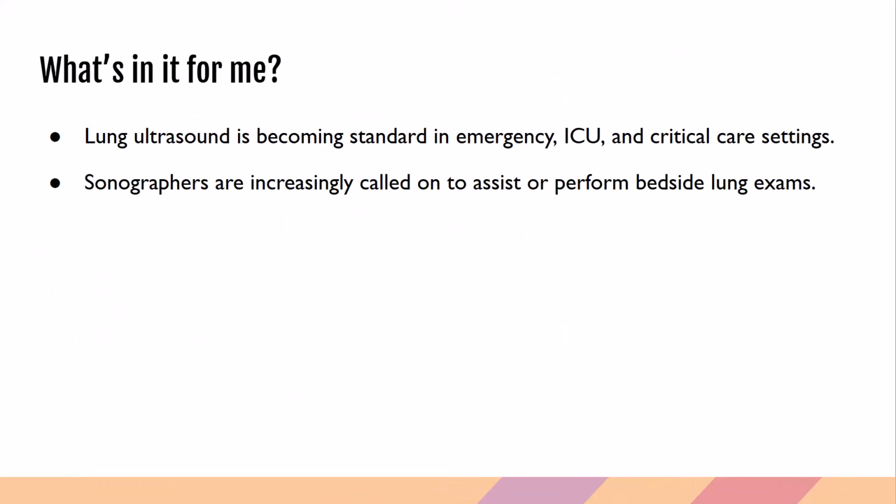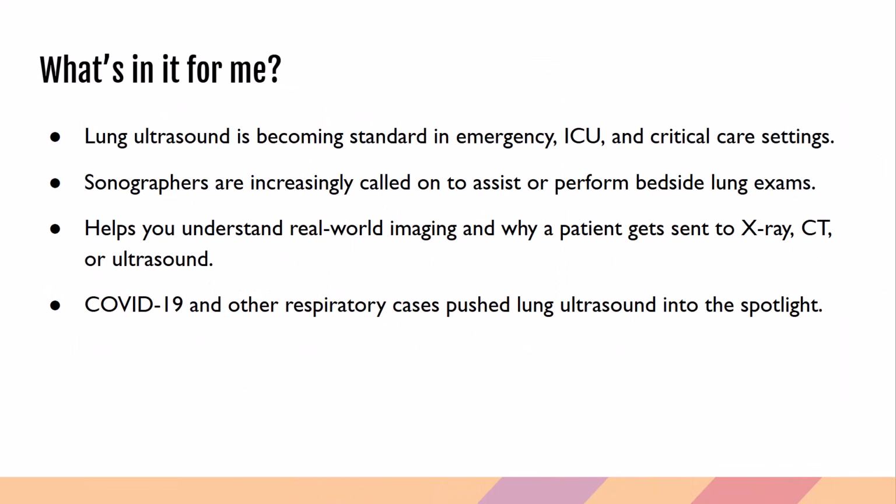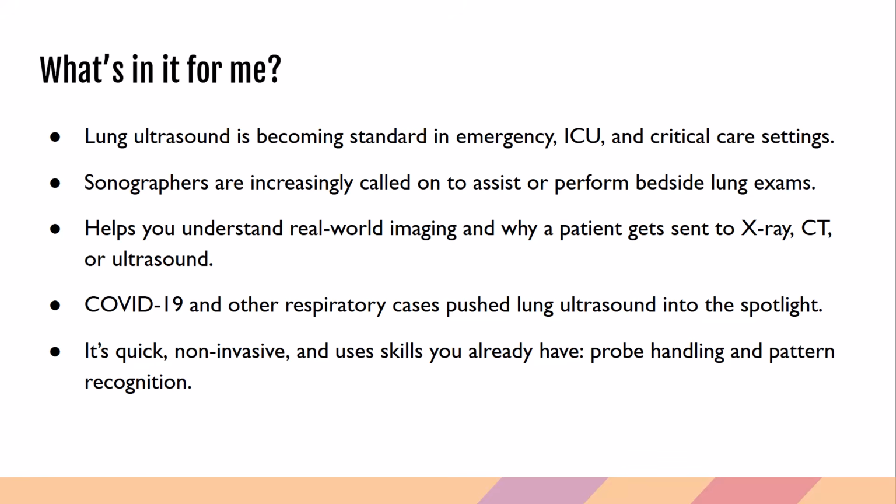So why should you care about lung ultrasound? Well, for one, it's really showing up everywhere. Emergency rooms, ICUs, inpatient units, even in ambulances. And COVID-19 really made lung ultrasound even more visible.